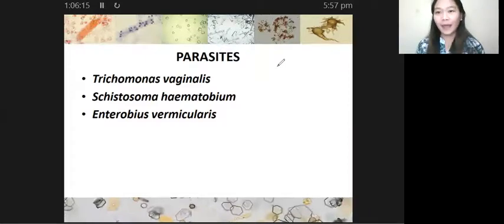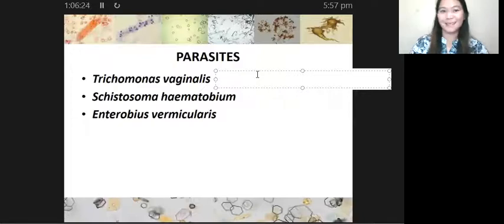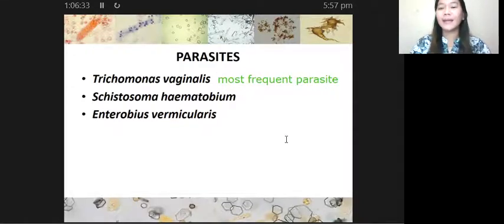Anyway, Trichomonas vaginalis. Trichomonas vaginalis, class, is the most frequent parasite seen in our urine. Why? Let's go back to your parasitology. What sample is used in the demonstration of Trichomonas vaginalis?